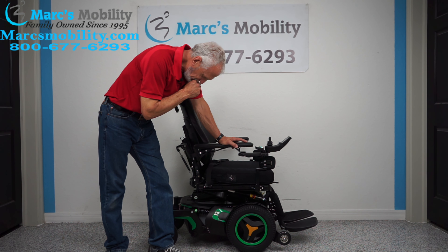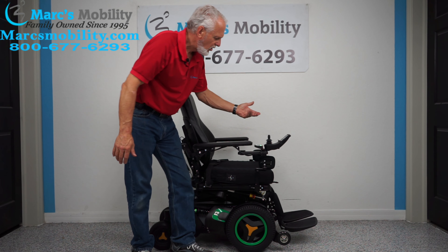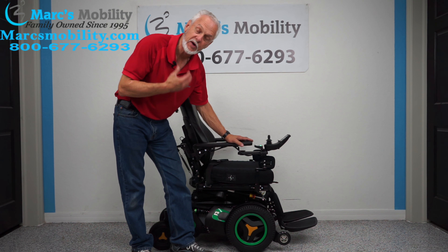All the functions — if you want to raise and do all that kind of stuff — can be done through the joystick or through the switch box right here, right behind the joystick. I like to use this one; it's quicker for me.